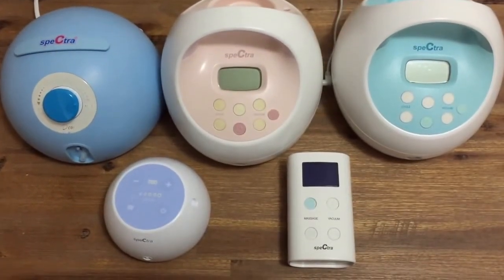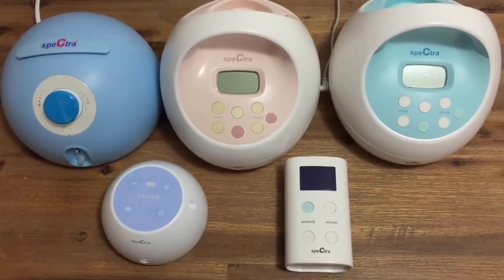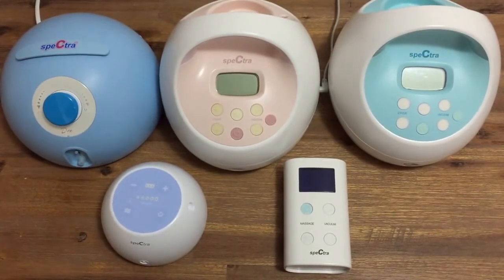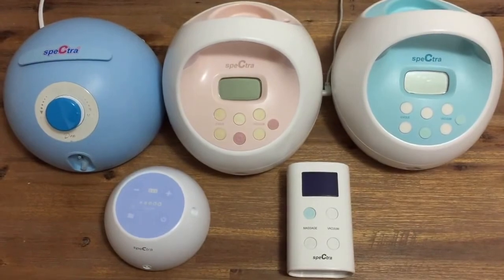I'm now going to demonstrate the cycle and suction settings of each pump for you. You will also be able to listen to how the pumps sound at different levels. Please remember that each pump will always be louder when the tubing is not attached or if the flange is not against your breast.